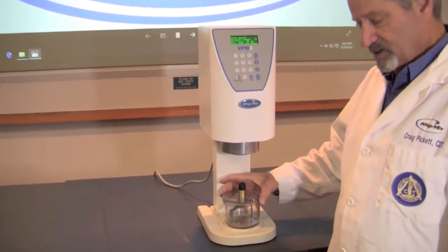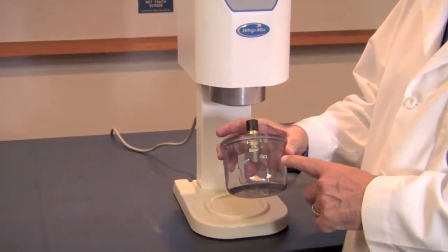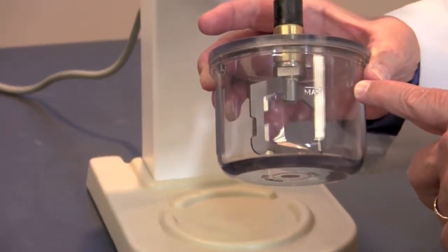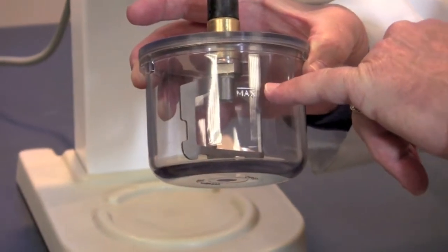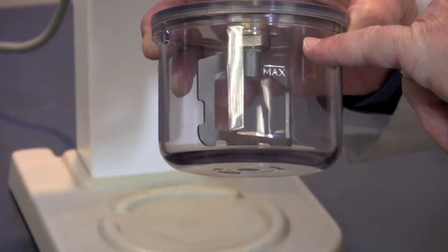Many times in our rush as technicians to get a lot done, we put a little too much inside one of these mixing bowls. There is a max fill line — this is a powder line — on every bowl and we shouldn't extend beyond that.